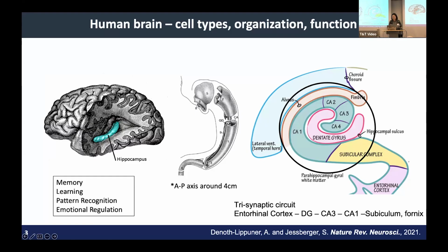This is a dissection of the whole hippocampus from anterior to posterior. If we take a look at the mid-hippocampus section, we can appreciate that there are multiple layers of the hippocampus. The pink one here represents the dentate gyrus. These are layers of granular neurons. They're small, densely packed, and very round. Those are the commanding center in the hippocampus, making the long-term and short-term memory and also giving decisions to different other regions of the brain.